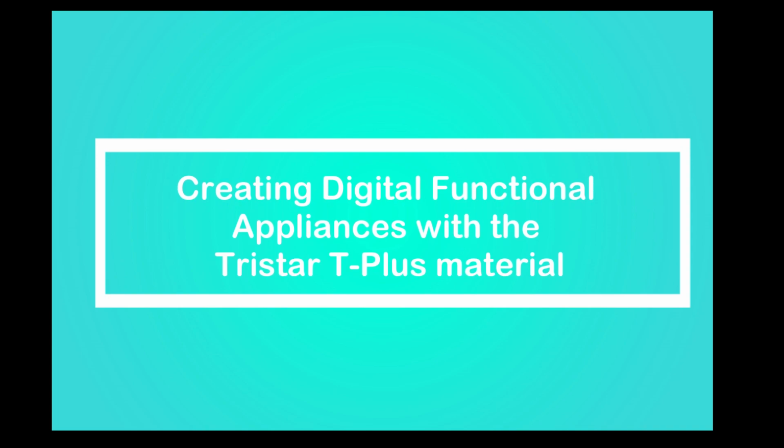In this video, we will show how to design and utilize the Tristar T-Plus functional appliance material as well as a clinical case using Tristar T-Plus to treat a growing Class 2 Division 1 malocclusion. Step 1. Adjusting the upper occlusal.